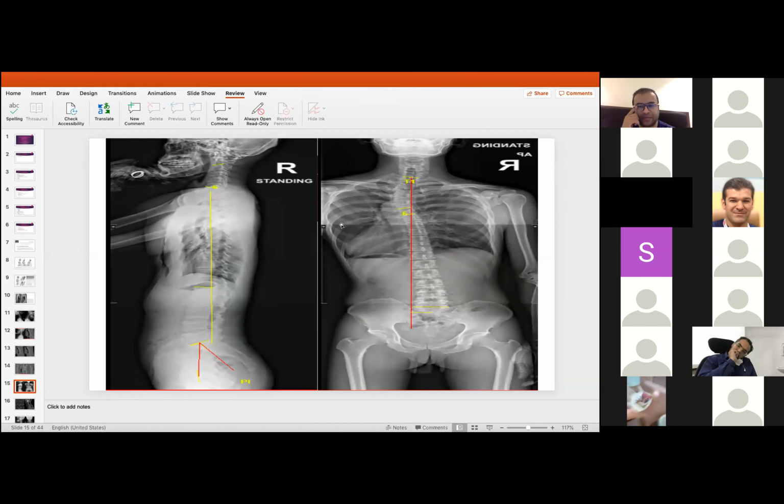This patient that we've done, if you look into his images prior to the surgery, you can see flat T1, but also shows you after doing these standing views that he's hypo in each one of these curves. So there's some harmony in the sagittal alignment. If you disrupt that by going lordotic at the cervical level, that will get him kyphotic above the fusion level, and will make his life difficult. So this is something I learned.